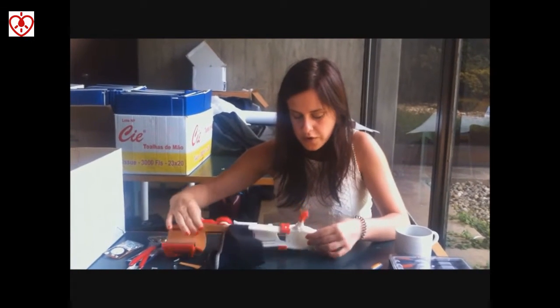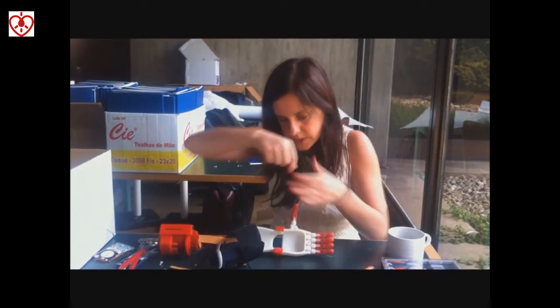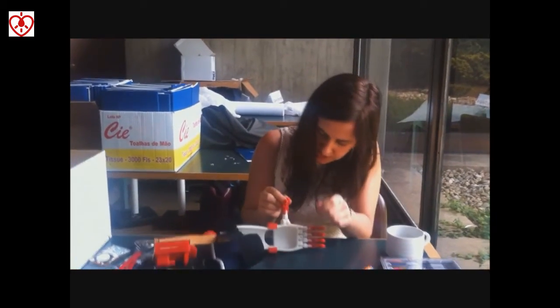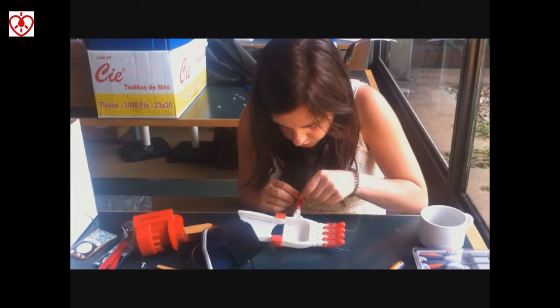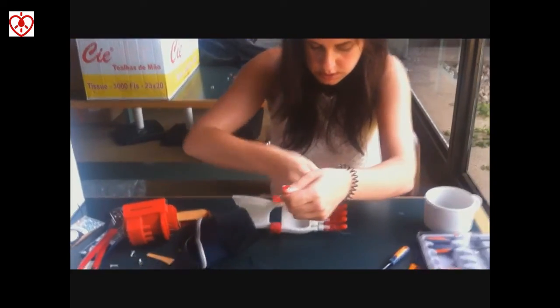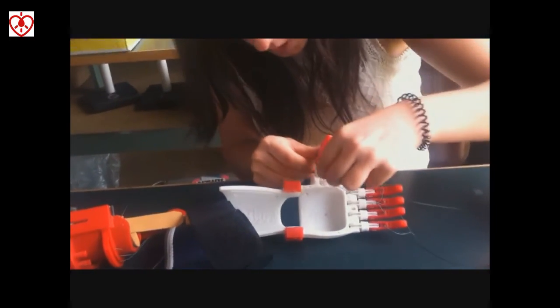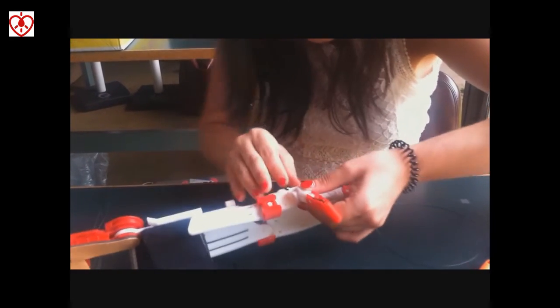I'm going to show you how we simulate the tendons and the muscles — they are represented by fishing line. We get the fishing line stuck in here at the tip of the finger, and then it goes through this channel like this, simulating the tendon, and then it goes this way.